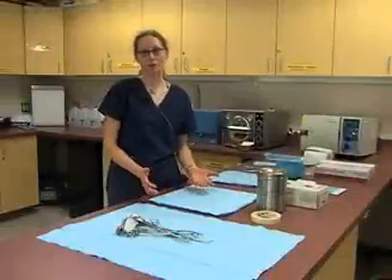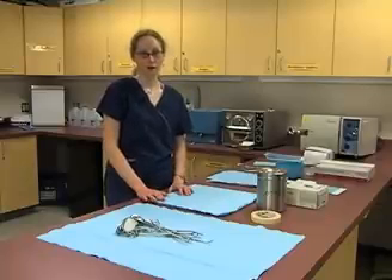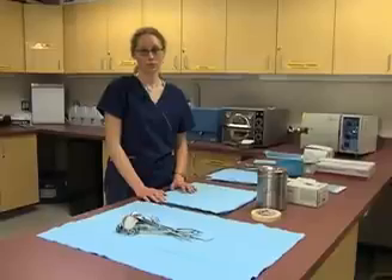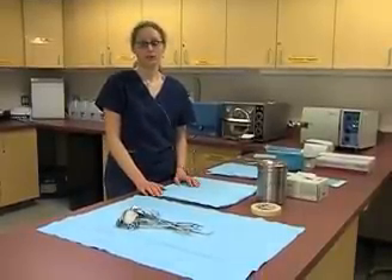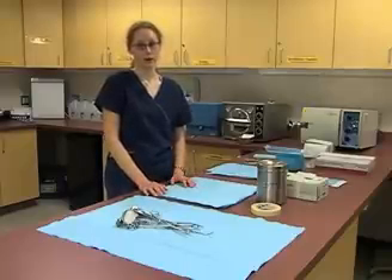We're going to take a look at how to run an autoclave and how to prepare surgical tools for the autoclave. In a doctor's office, there are a variety of tools that need to be used for non-sterile procedures and for sterile procedures. There are certain ways that we must prepare these tools before they can be used in the office.